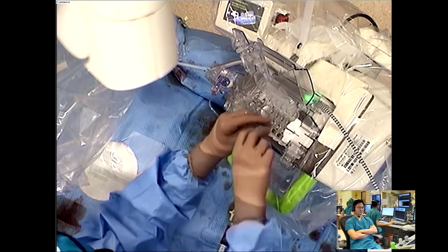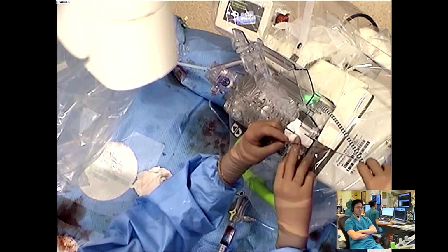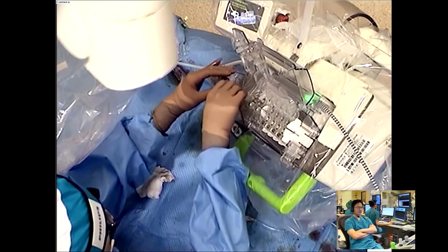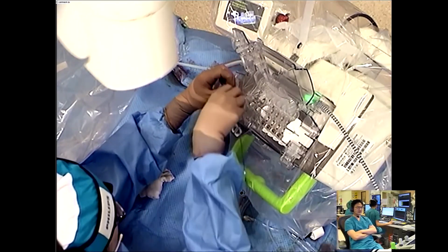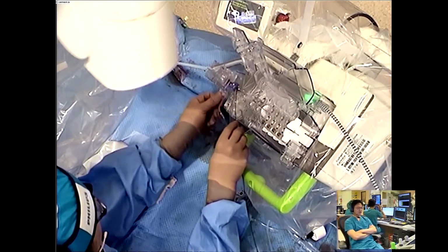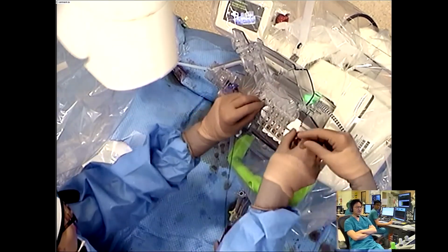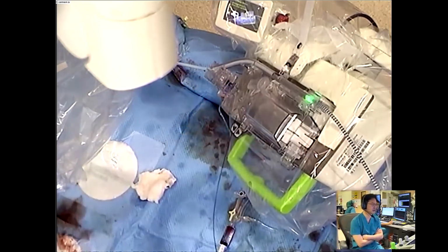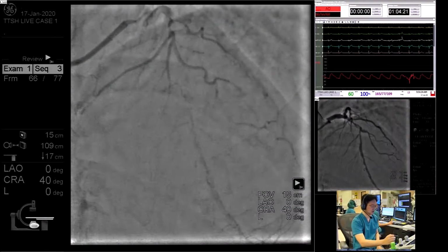Paul, so it's actually very accurate in that measurement. Since you've been doing so many cases, do you see that with this more accurate measurement you're actually using fewer stents? That's what has been shown in the robotic PCI trials, right? We tend to use more stents than a robot. Yeah, I don't think I've actually done enough to really convincingly say that's the case. But I certainly think in this particular patient, we want to land the stent reasonably close to the ostial LAD and not into the left main. So I think we should be able to do this quite nicely.